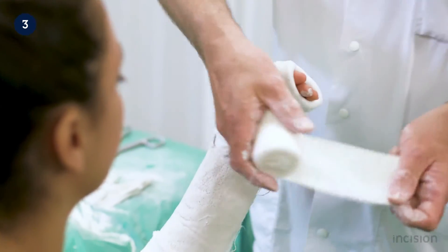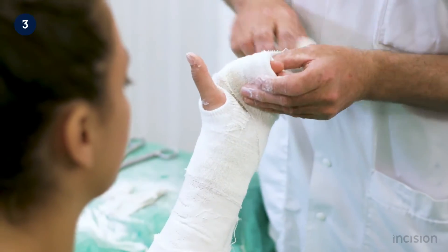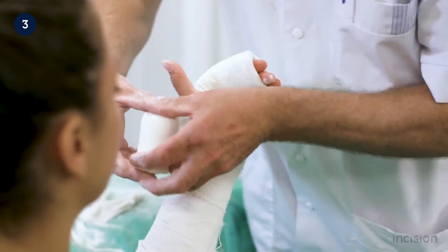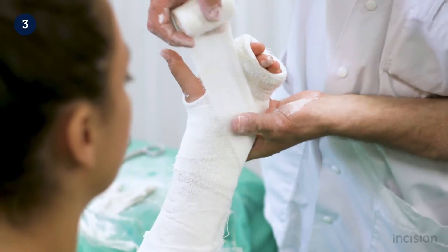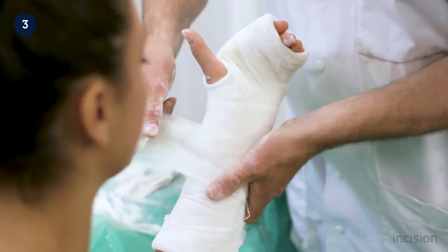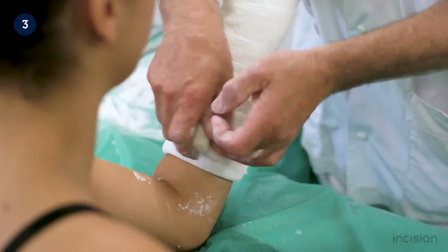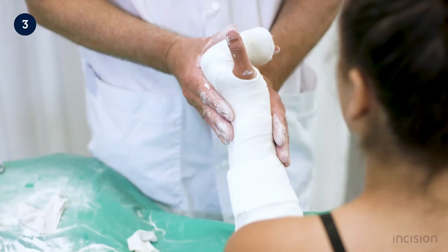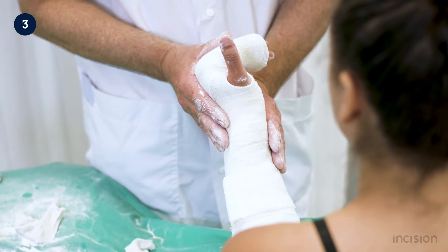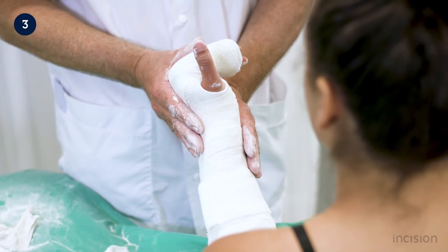The elastic wrap is then applied to the limb in the same manner as the padding, with the flat part against the surface of the plaster. Although the elastic wrap is applied under tension, care is taken not to apply too much tension as this may compromise blood flow in the digits. The elastic wrap is applied to the entire length of the forearm, and the plaster is molded again in the intrinsic plus position using three-point fixation until the plaster is sufficiently hardened.